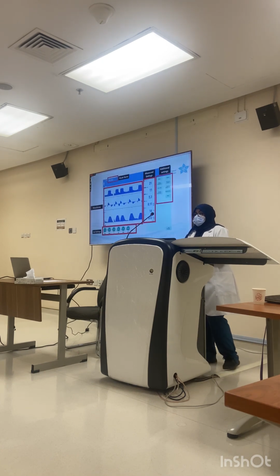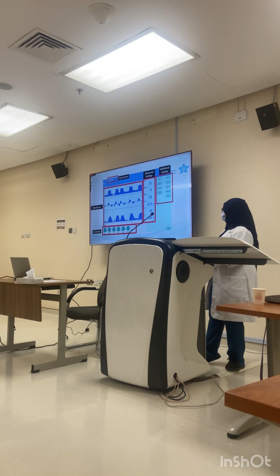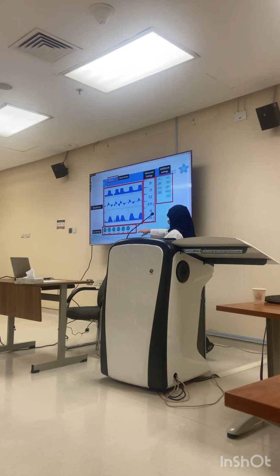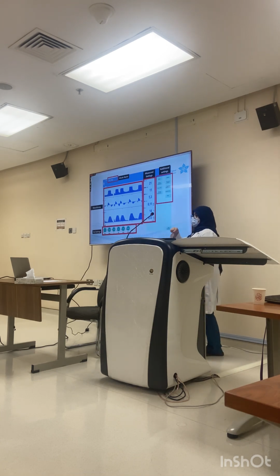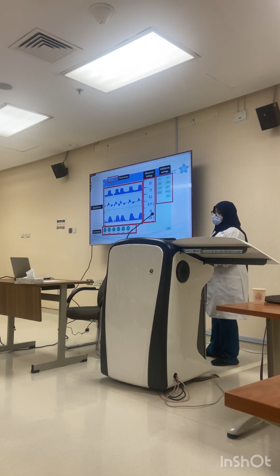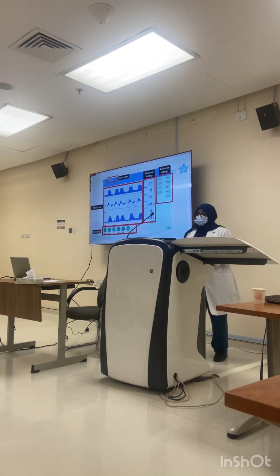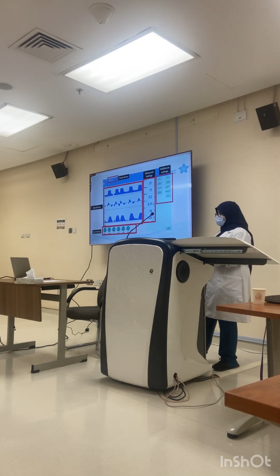Okay, here we have a view of a screen of a ventilator. We can see in the upper left corner the name of the mode. So it's basically telling us what mode we are using. This is the waveform. The machine is translating the mechanical breath based on graphs or waveforms. We have a pressure wave, flow wave, volume wave, and here in the bottom we have the set settings. Set settings are the basic settings to monitor the mode.